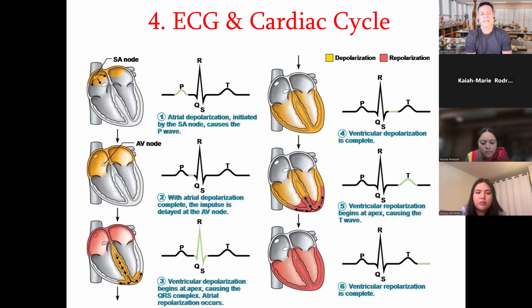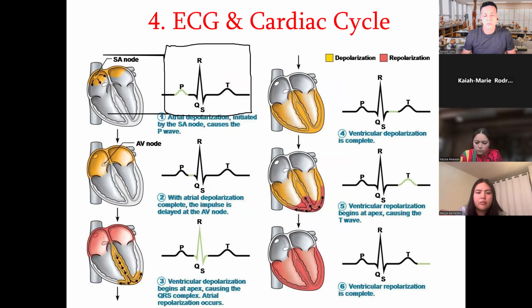What is ECG, guys? ECG stands for electrocardiogram. And an ECG is going to give us information about the health of our heart, how well our heart is beating. And it's going to tell us about the cardiac cycle. Okay? Now, what we're looking at right here on the screen is the result of an ECG showing a single heartbeat, which is about 0.8 seconds. That's how fast a single heartbeat is.